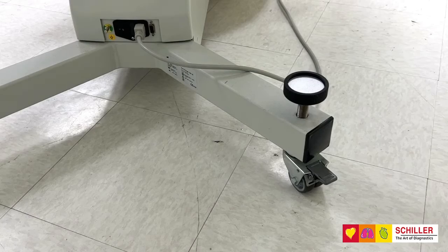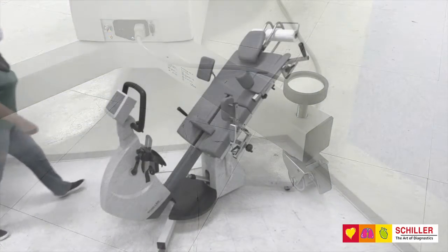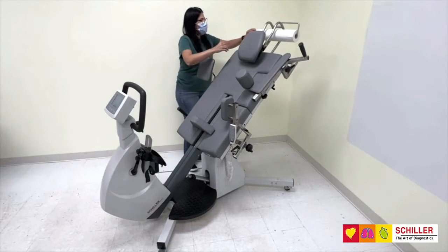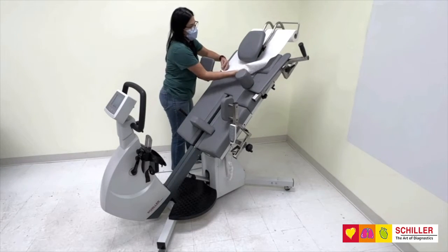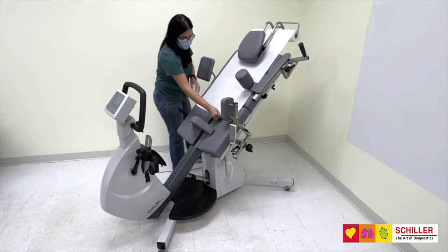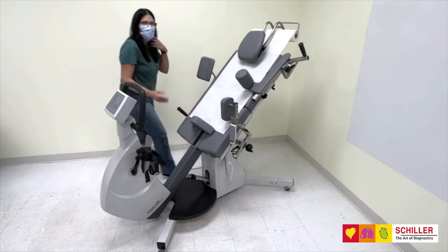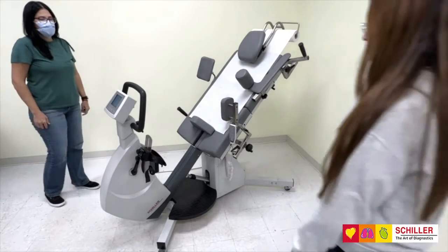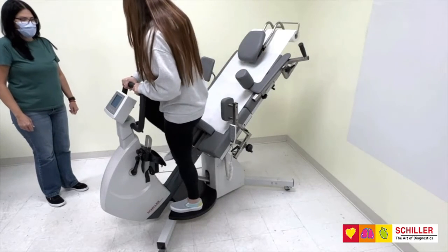The base is equipped with lockable heavy-duty rollers. The paper roll carrier situated under the headrest allows for easily replacing the sanitary paper sheet between patients. The footboard and handlebar serve as mounting safety aids.